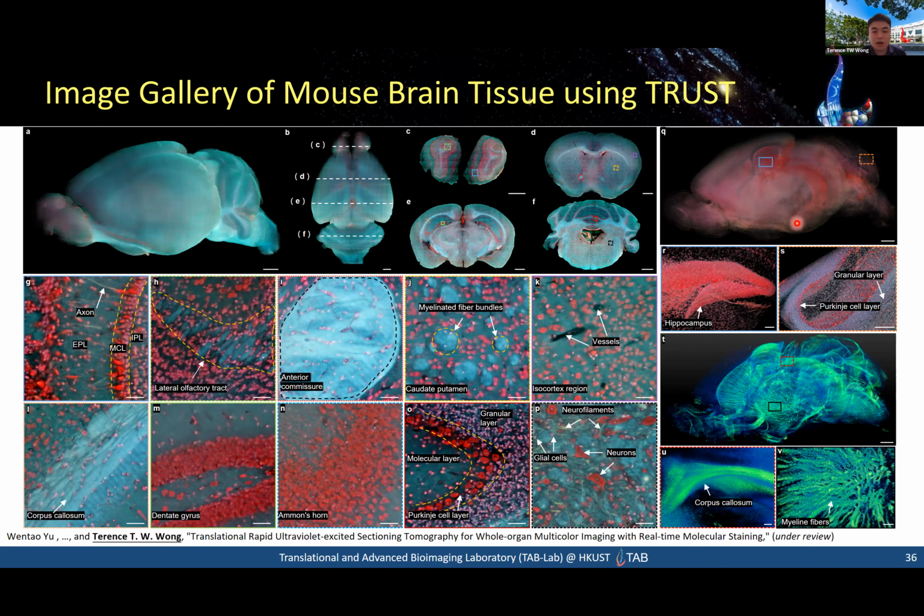And because it's RGB, I mean, the image is colored, we also can play with different color channels and do some sort of data processing. We can also extract blood vessel structures. At the end, we can also project them nicely in different ways.